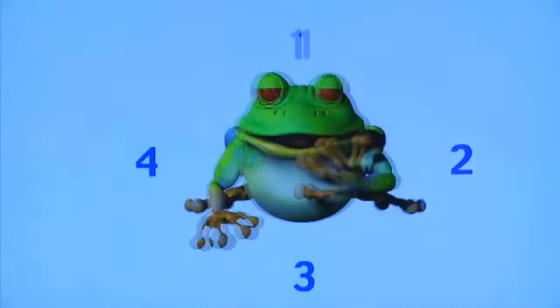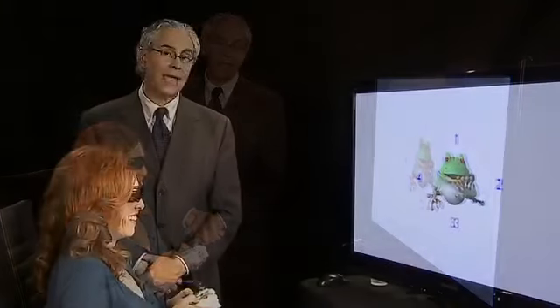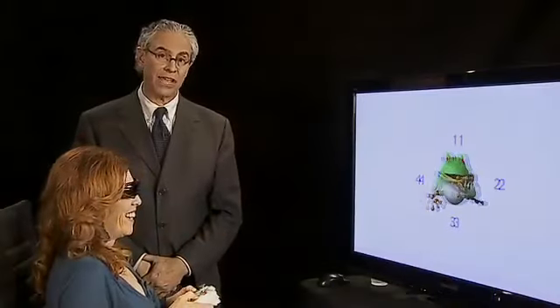Yeah. Great. These techniques can also be done with regular stereoscopic targets. And frog is an example where there are numbers 1, 2, 3, and 4. Only one of the numbers is popping out. Kelly, make a response to the number that's popping out. And the task is similar to that of a random dot stereogram, except using a stereoscopic target that has contour to it. Oh, that's a little tough because I feel like the frog is coming toward me. You're doing a great job.